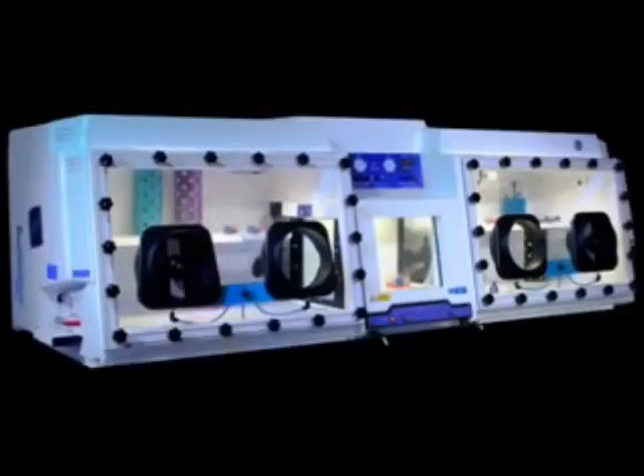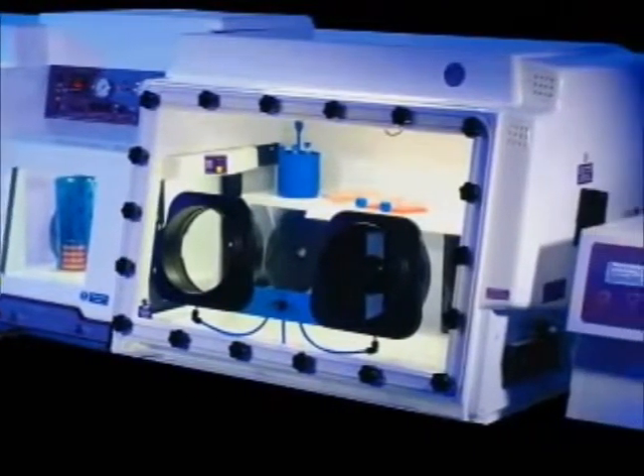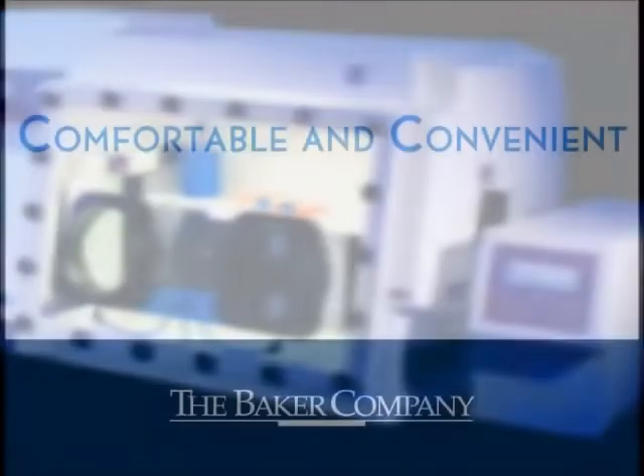Designed for larger laboratories, the Ruskin Concept 1000 anaerobic workstation offers a 1000 plate capacity and features two independently controlled environments, each accessible through a large central interlock. The workstation can be configured with an optional gas mixing module to create a micro-aerophilic atmosphere within one of the chambers.